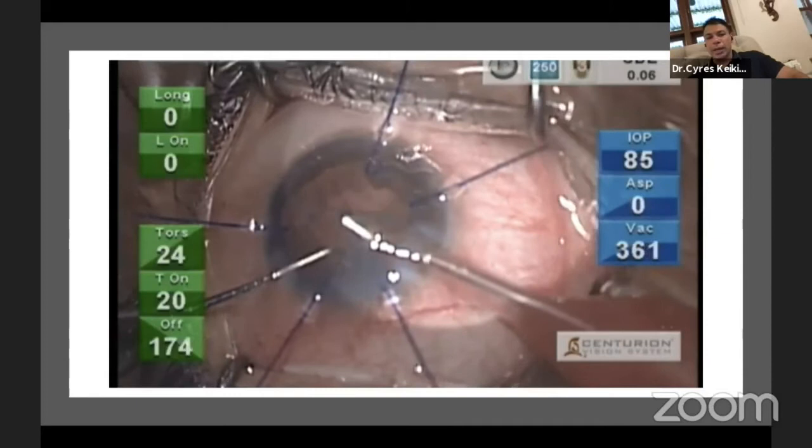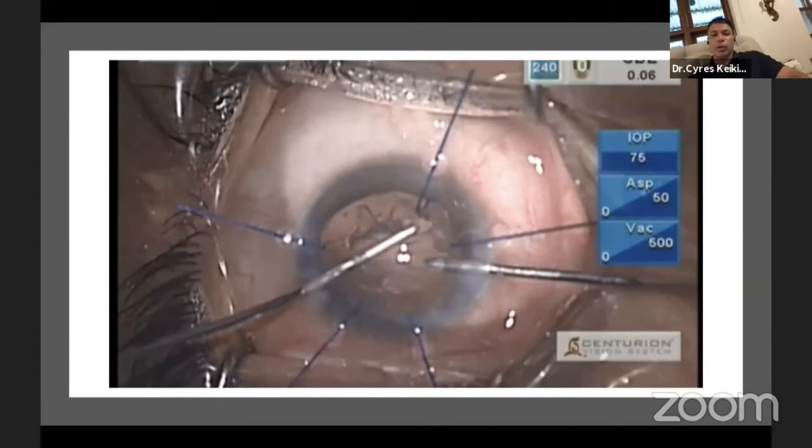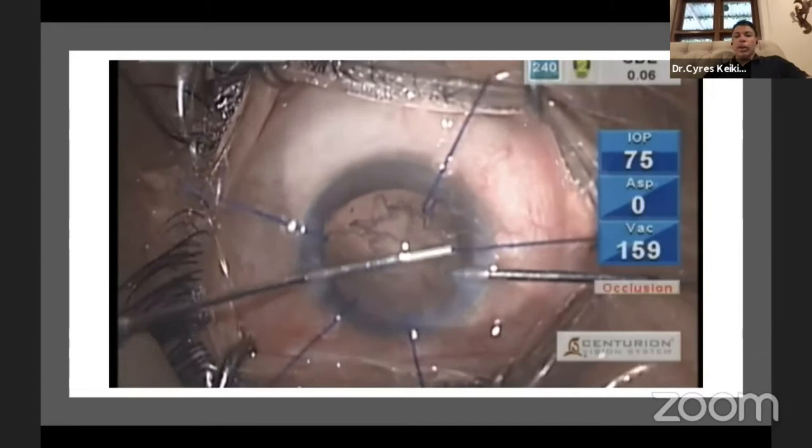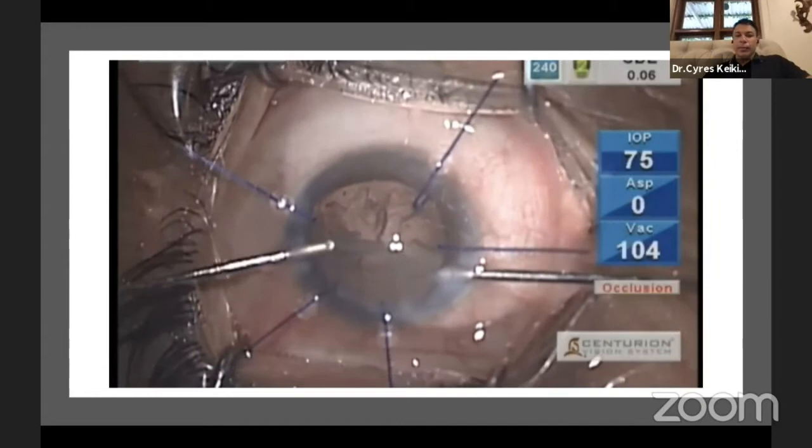Once the nuclear job is done, the next step is irrigation and aspiration. In a case like this, be careful not to pull the capsular bag off the hook. Even with five hooks, pulling it off just one will destabilize the bag in that region, and peeling the cortex without counter-traction becomes more difficult.